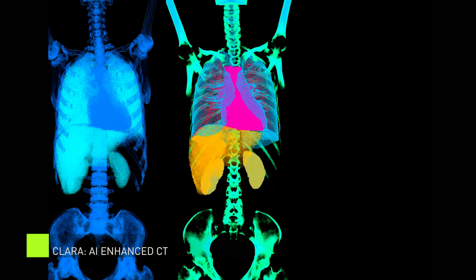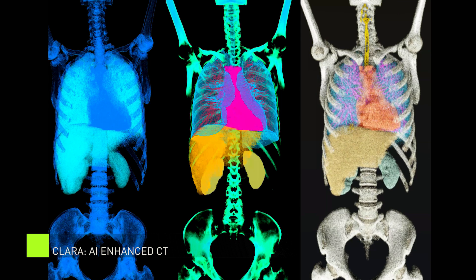What you are looking at is a 3D volume generated from a CT scan. By using techniques like ray tracing, realistic materials, and realistic lighting, we create a cinematic quality image of human anatomy that is easy for anyone to understand.